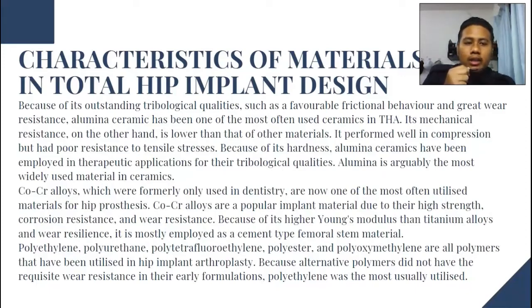It performed well in compression but had poor resistance in tensile stress. Because of its hardness, alumina ceramics have been employed in therapeutic applications for their tribological qualities. Alumina is arguably the most widely used material in ceramics.